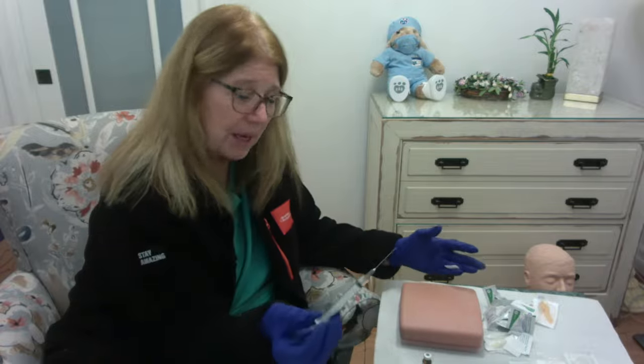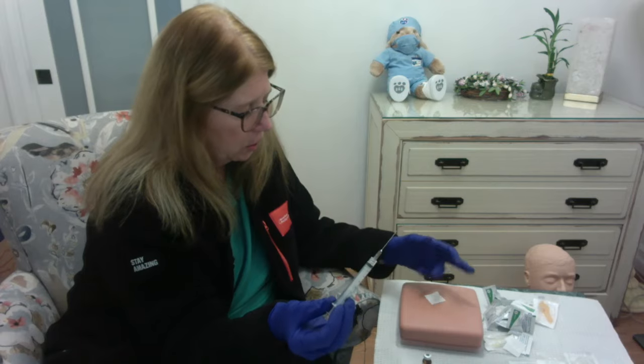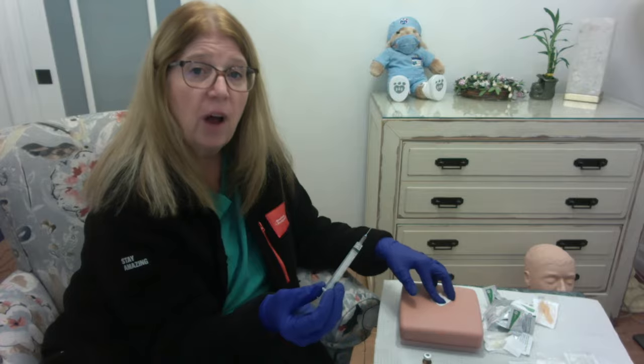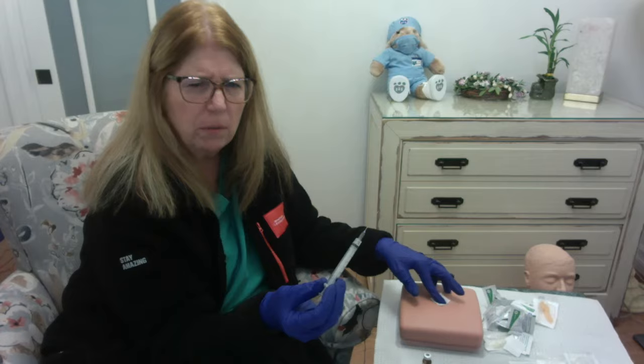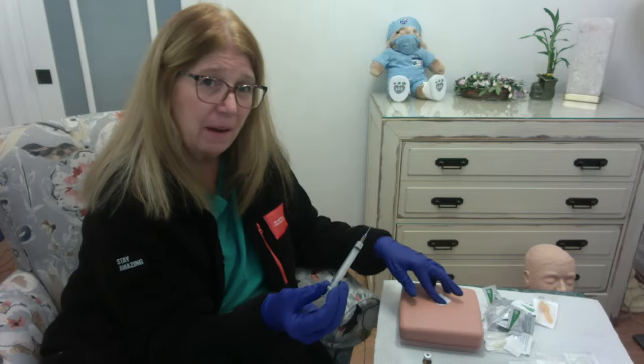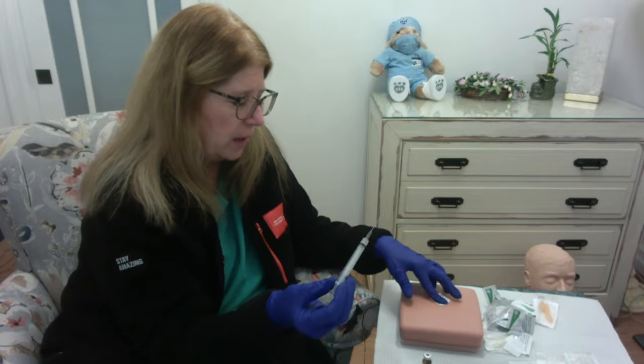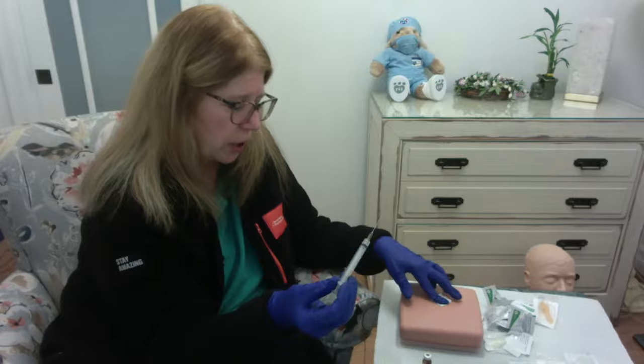I take out my needle. I use that alcohol swab to cover the area and do a little massage, okay, because it's painful, all right? I may have to put a Band-Aid on it if necessary, all right? So that is our IM injection.